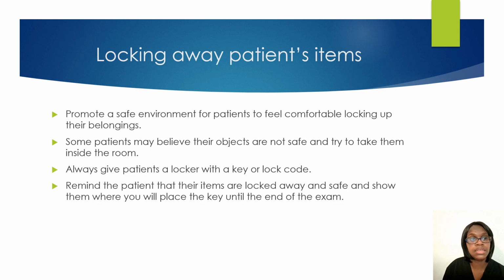Give the patient a key so that they can know where you are putting the key whenever you do get inside the MRI room. And just reassure them that their items are locked away inside of a locker.